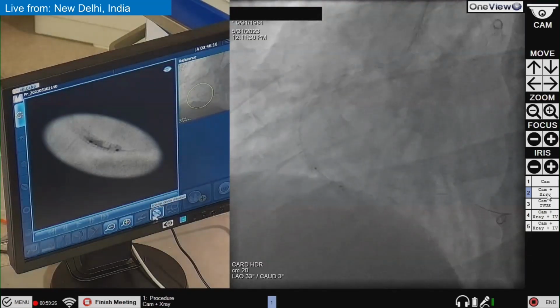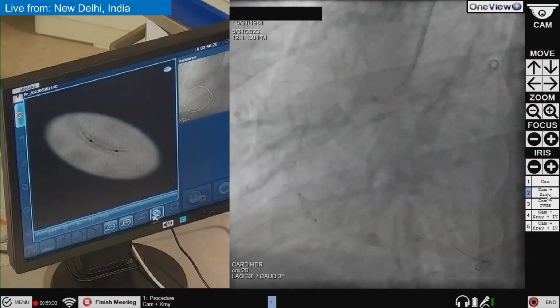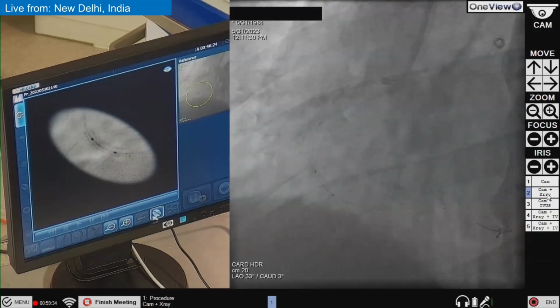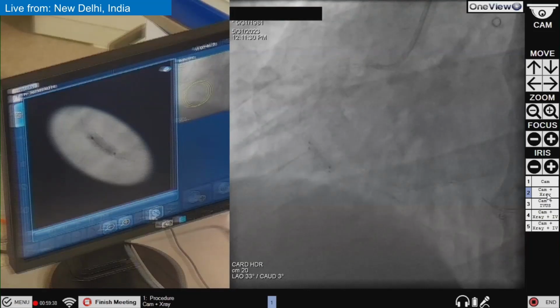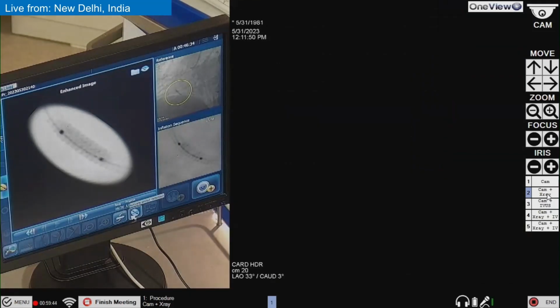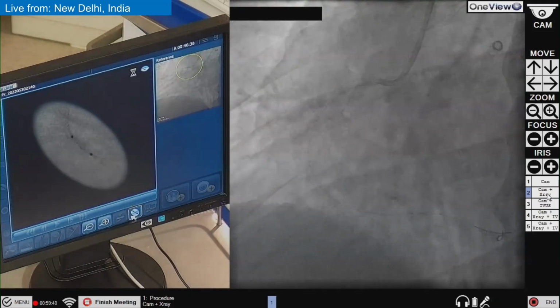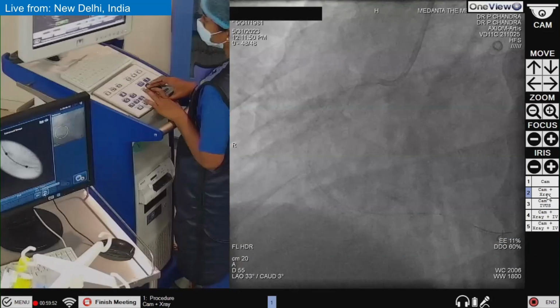So this is the stent distal edge boost, yeah, which is an online stent boost, and very nice. And we don't need to do repeated shoots with this. Go up 2, 4, 6, 8, 10, 12, 14, 16. Okay, deflate. Fine. I think we are done. Okay. Yeah. So we will do an OCT finally, and that's it.